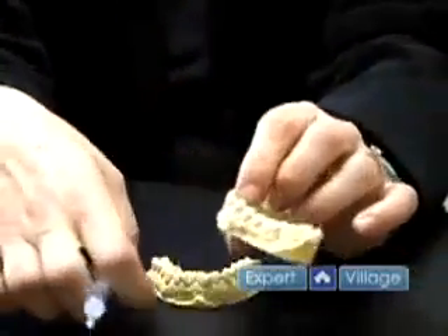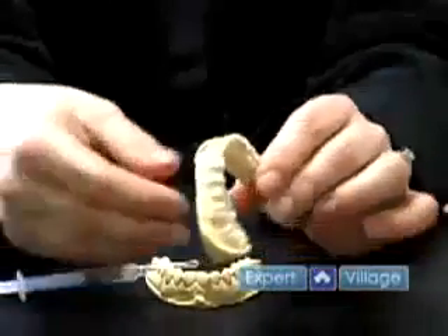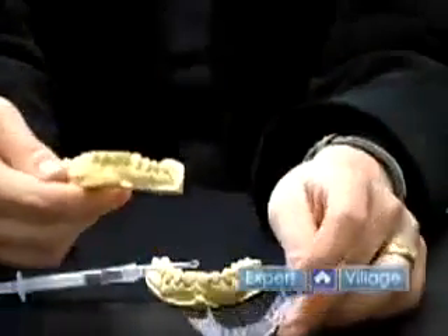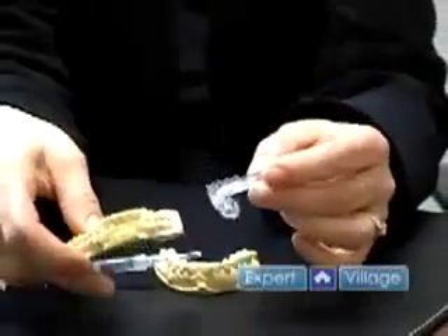You would wear the tray with the gel for whatever amount of time your dentist has recommended. Upon taking the tray out of your mouth, you want to make sure that you get all the bleaching material out of your mouth as well. So you would brush your teeth thoroughly and floss, and then you clean the tray afterwards.